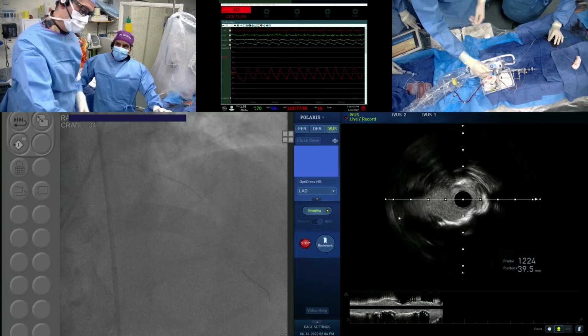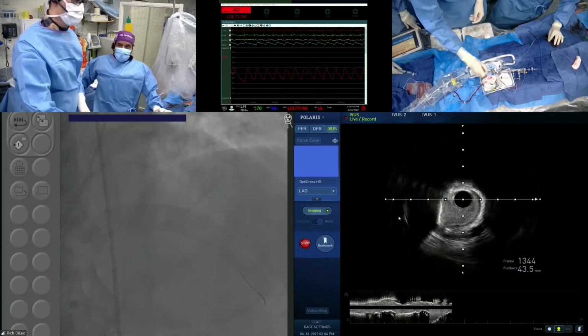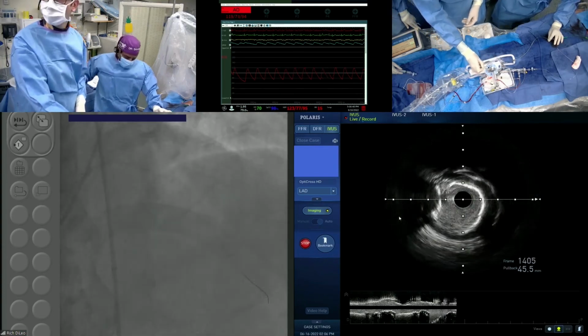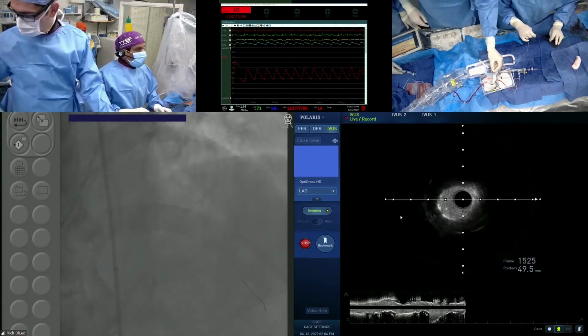And now we are going to come a little proximal. This is the proximal part. Still good. Still coming. Good. With that note, what we are going to do is put in a stent.